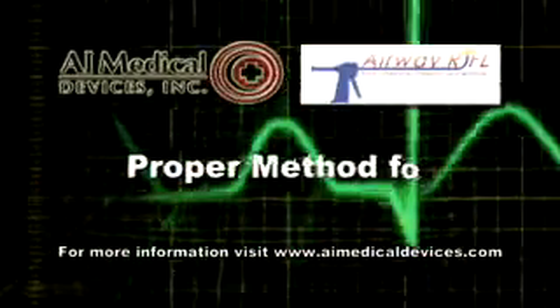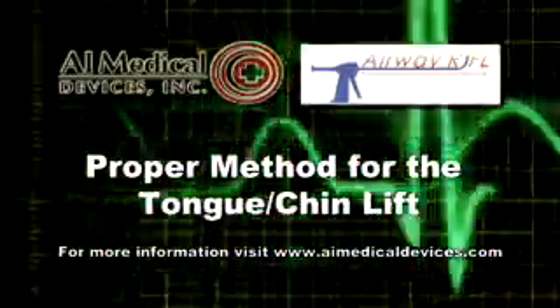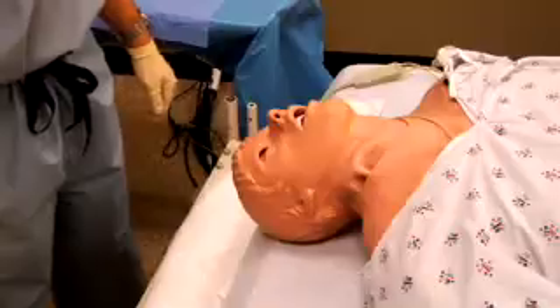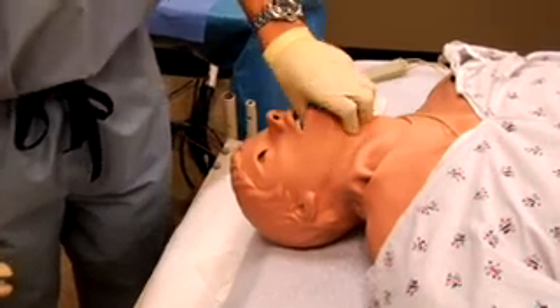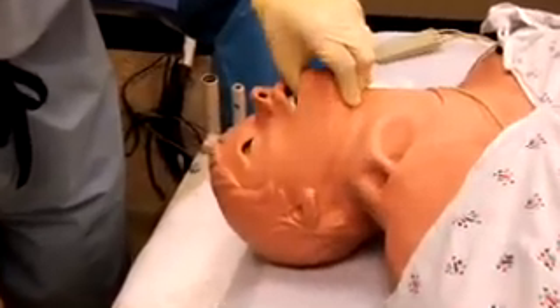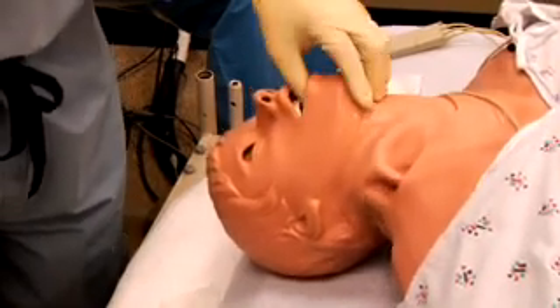For the successful use of the airway scope as a stand-alone device, it is essential to learn the correct method of doing a tongue-chin lift. The practitioner must insert their thumb deeply into the oropharynx and grasp the tongue with the thumb and the chin with the fingers, then lift the tongue and chin upwards.